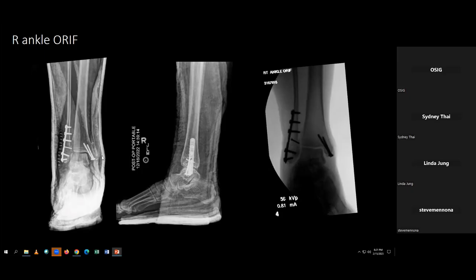Yeah, so the ones medially, like Jomar was talking about in his talk, there's threads in this part and no threads here. So the point of that is that this bites the bone and this glides. The technical name for that is lagging by design. These are partially threaded screws.